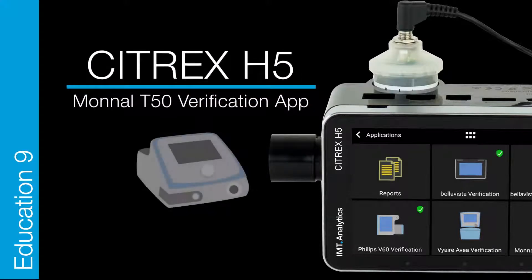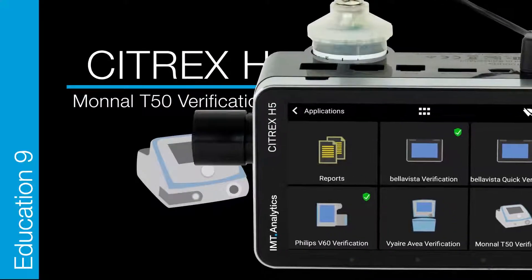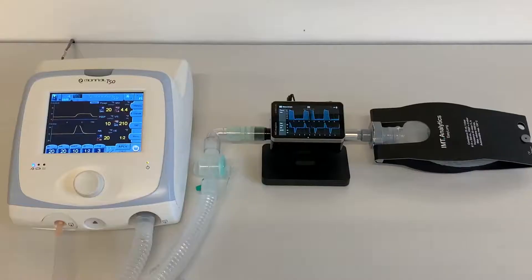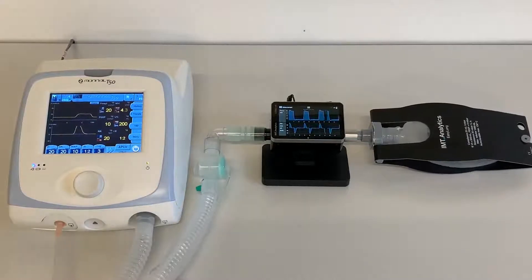Citrex H5 Education — Monnal T50 from Air Liquide Medical Systems. Let's start. First, set up the Monnal T50 ventilator, Citrex H5 gas flow analyzer, and a test lung.